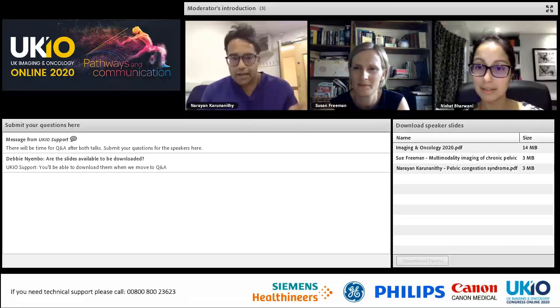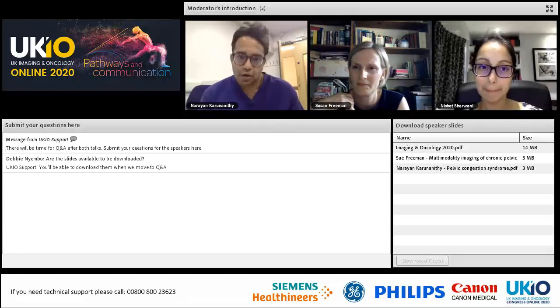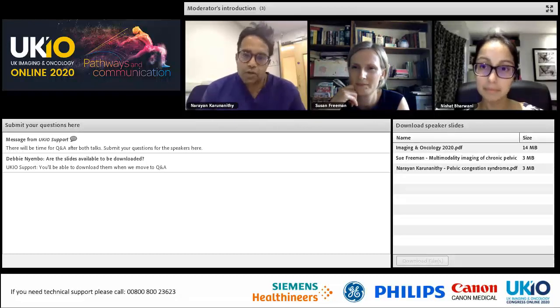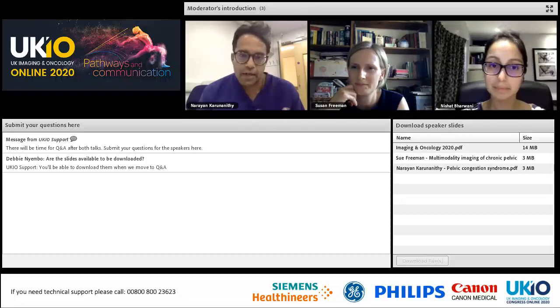If they haven't had a gynae pelvic MRI scan done, we do a two-part exam, which includes a gynae pelvic MR, which the gynae radiologist reports, and then an MR venogram, which I invariably report. And the additional sequences that we do are mainly, high-res T2s are usually already done. We do an inversion recovery, and we find that the balanced steady-state precession acquisitions are also very useful. We don't give any gadolinium to do any post-gadolinium acquisition.